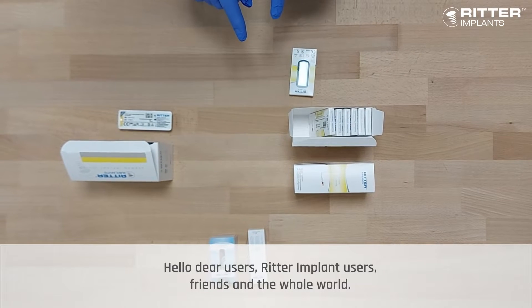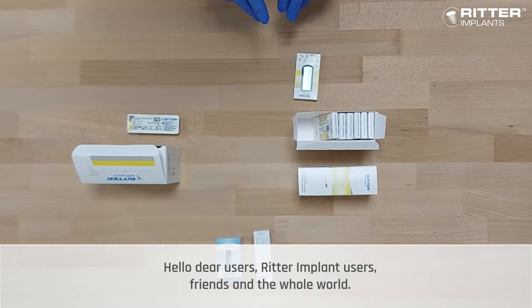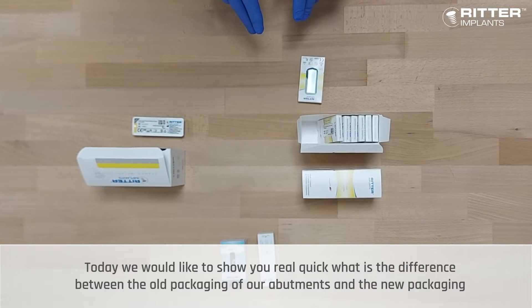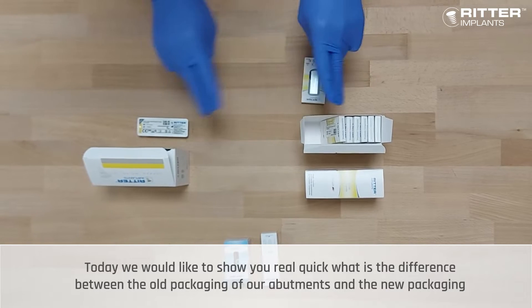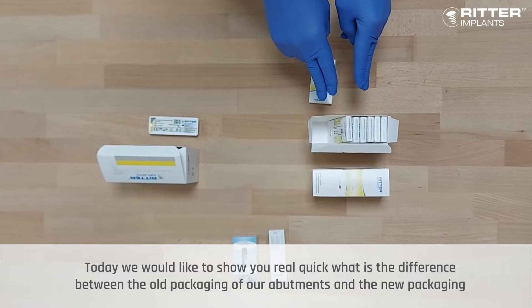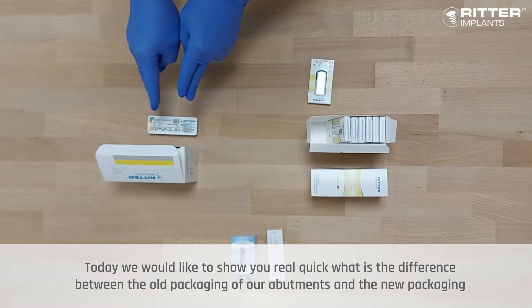Hello dear users and Ritter Implant users and friends in the whole world. Today we would like to show you real quick what is the difference between the old packaging of our abutments and the new packaging.